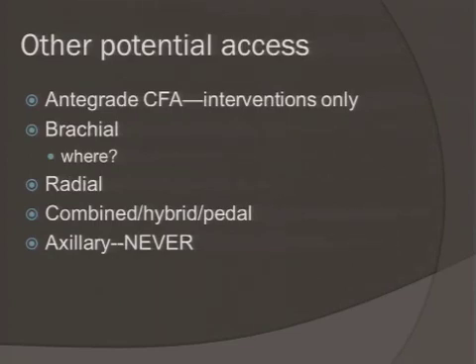Other options. So those of you, anybody done a brachial puncture? So residents or fellows, or obviously we had some attendings here, I'm sure you guys have done that, but brachial artery access. So brachial artery is tricky, and I think one of the main things we think about with brachial artery access is where in the brachial artery. I think many of us now, certainly me included, really favor a much more distal brachial artery access, typically at the level of the antecubital fossa.